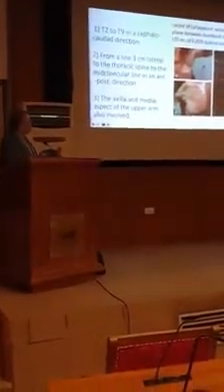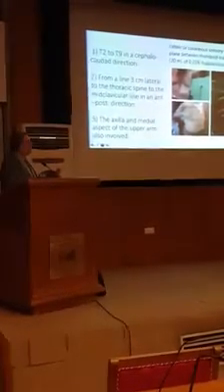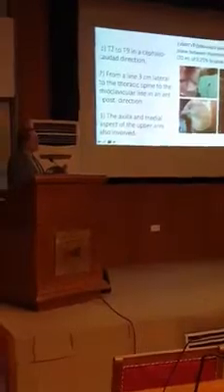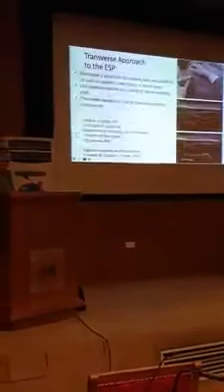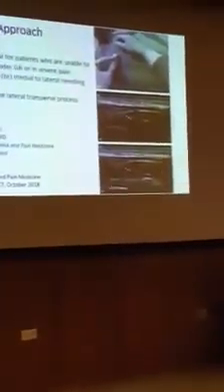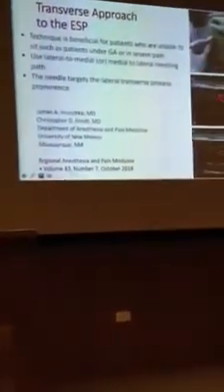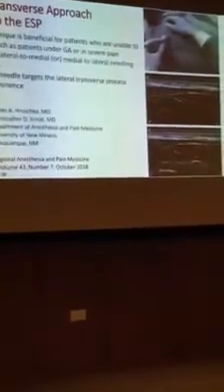In the anterior posterior direction, from approximately the mid-clavicular area anteriorly to 3 centimeters from the midline posteriorly, and it involves the axilla and upper medial aspect of the arm. This block can also be done in a transverse approach, like in this case, for a patient who cannot sit or is under GA. This is the needle and this is the transverse process.